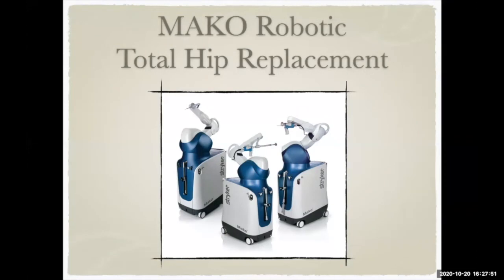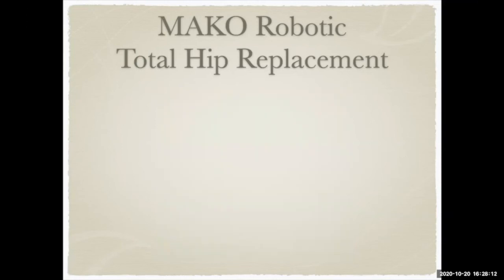And it is a robotic machine that comes on the base that has, you could see there with the Stryker logo on it, and it has this pivoting arm, if you will, an elbow right in the center, and it will move to positions to achieve certain actions during the operation that allow it really an infinite number of positions.